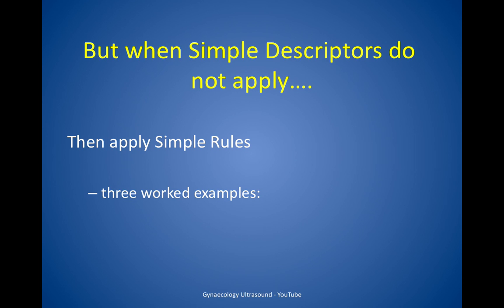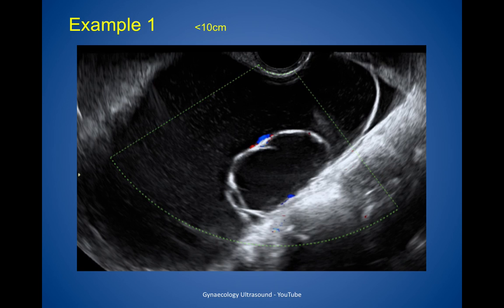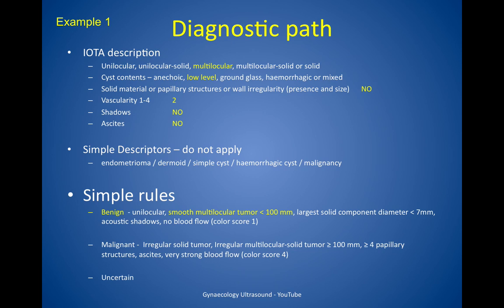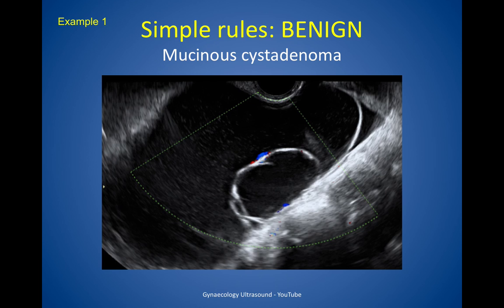Simple descriptors don't always apply, so that's when you need simple rules. Describing this lesion: it is multilocular with low level echogenicity, no solid material, some minor vascularity, no shadowing and no ascites — so simple descriptors do not apply. On simple rules it has one benign feature: it is smooth, multilocular, less than 10cm. There are no malignant features, and so on simple rules it's benign. This was a mucinous cystadenoma.